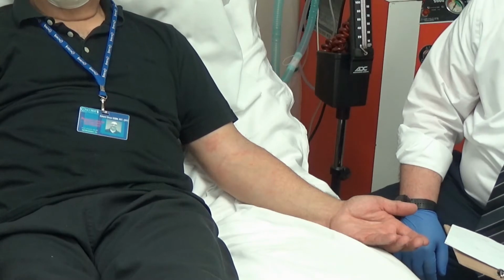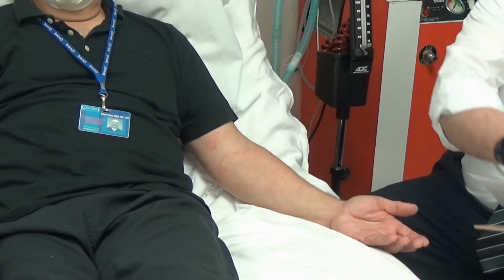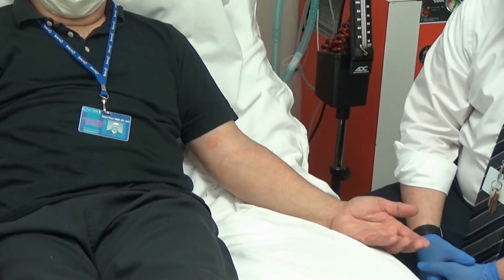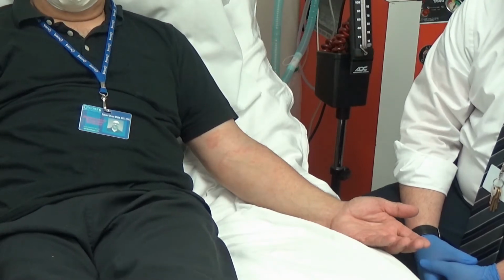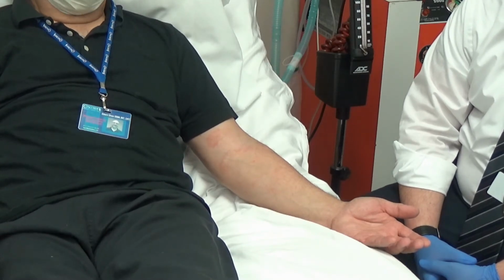Now we're going to talk about how to do a manual blood pressure. In actuality, in your RT240 term, you will be doing a rotation in pulmonary rehab, and at pulmonary rehab, they require you to do manual blood pressure. So this might be the first time you do it until you hit 240. So maybe practice every once in a while.